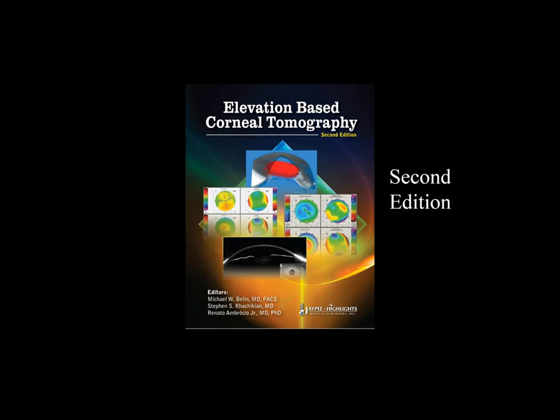Thank you. Last question for the evening is, how do you measure lenticular opacity? If you look at, and I don't have it in front of me, the Pentacam does give you the ability to do that. When you look at the Scheimpflug map, if you look at the far right of it, there's tracings which actually represent light transmissibility. And you can do it numerically.